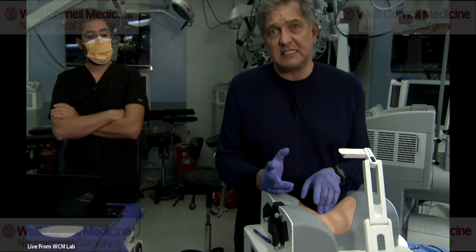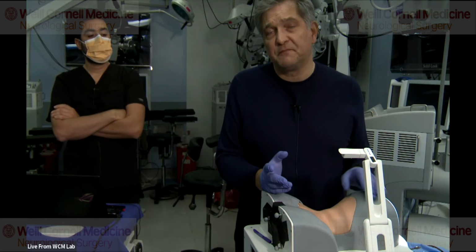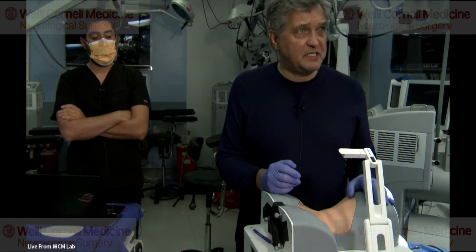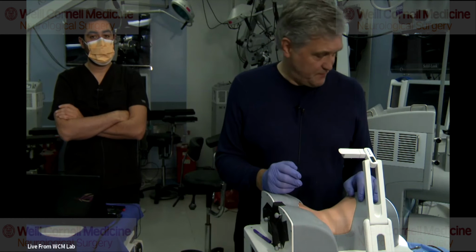If I did a case for cervical pedicle screws like C7 or T1 pedicle screws, I would probably not trust the Mayfield head holder reference, and I would actually put a spinous process clamp lower down. But for localization, it's perfectly accurate.